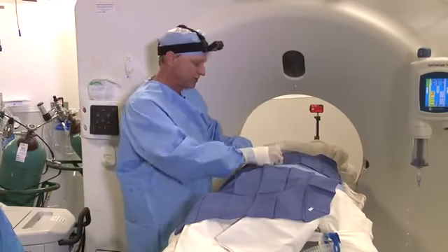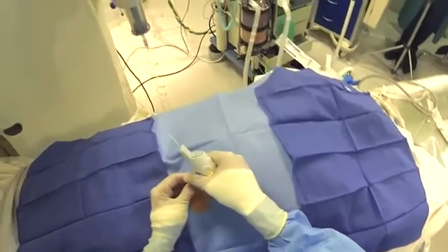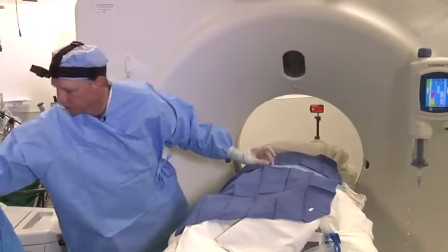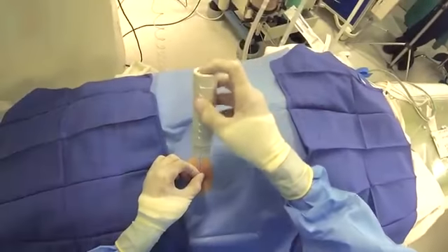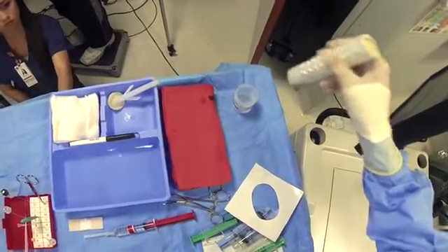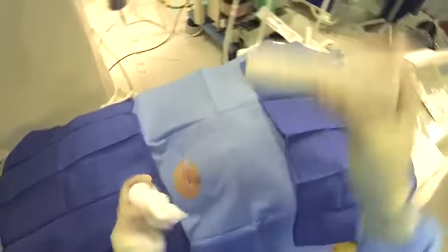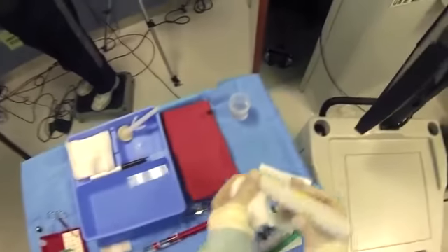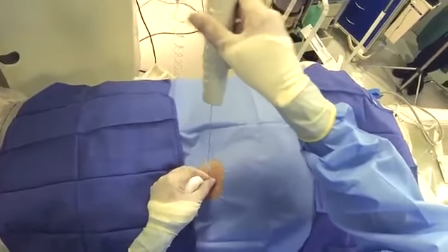So we're back with the patient. We're going to take our biopsy. The guide needle was a little deep. I'll just pull it back. Take a few 20 gauge cores here. Drop them right in the formalin. Looks like a nice core. I'll bias this needle caudally and take a biopsy. And biopsy in a more cephalic direction.